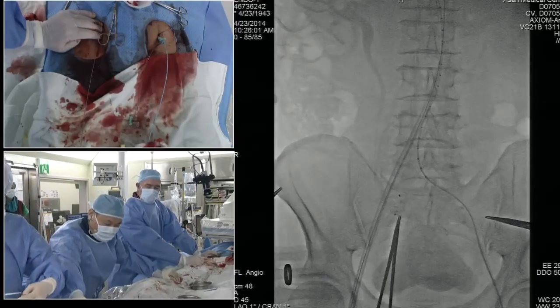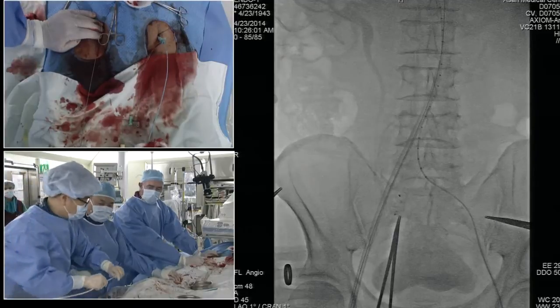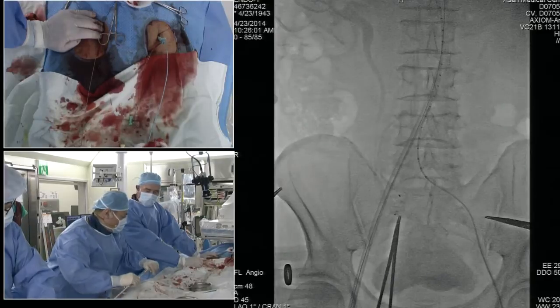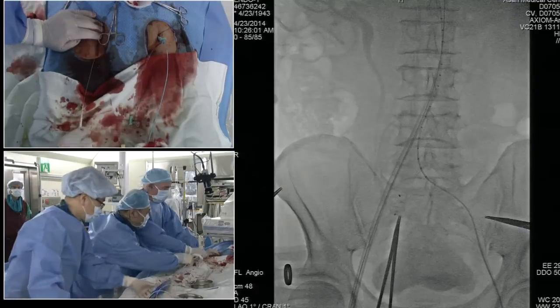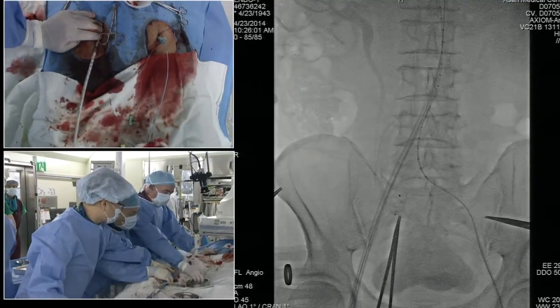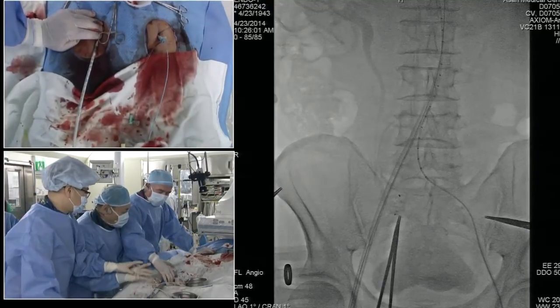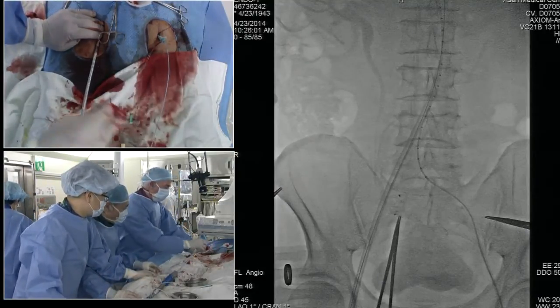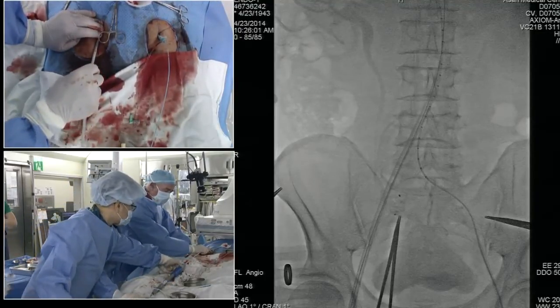So many of you are, I think, familiar with the Medtronic Endurant graft. It's a modular bifurcated graft with one docking limb. Has a suprarenal stent with attachment hooks. It's got a hydrophilic coating, which we're going to wet now. And we're going to want to have our limb probably that way. Yeah, great. So we're going to do a kind of traditional approach in terms of the deployment of the contralateral limb.